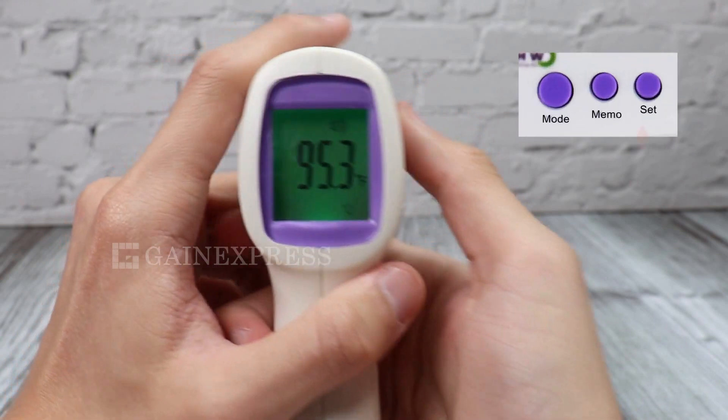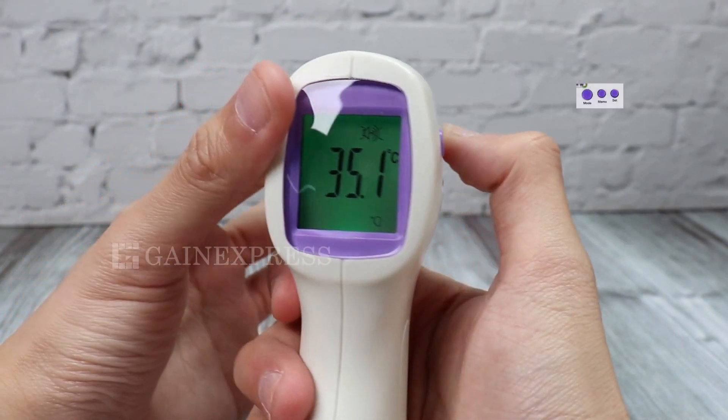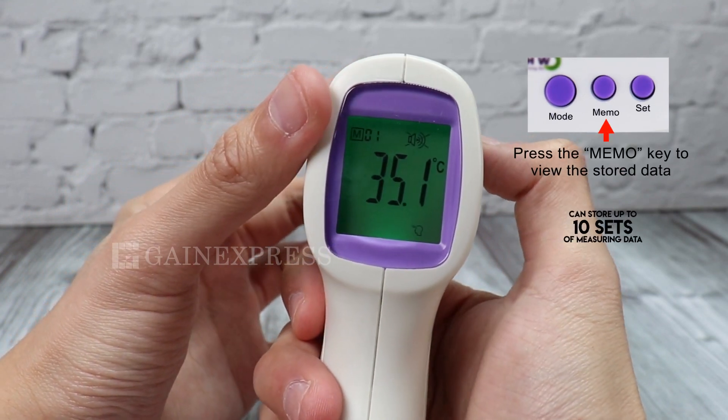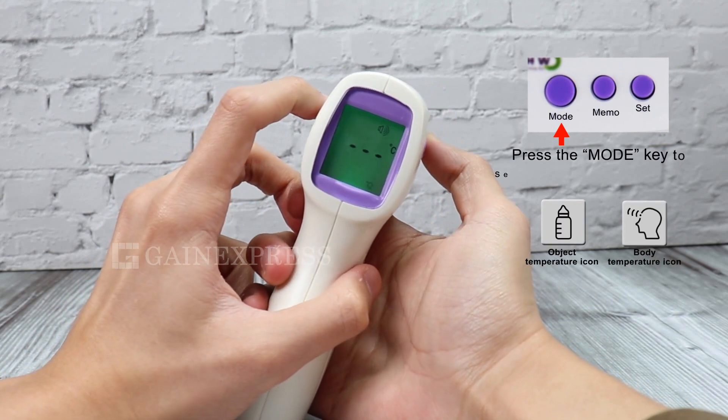To switch the temperature unit between degrees Celsius and degrees Fahrenheit, press the set button. It can store up to 10 sets of measuring data. To view, press the memo button. Press the mode button to switch measurement mode.